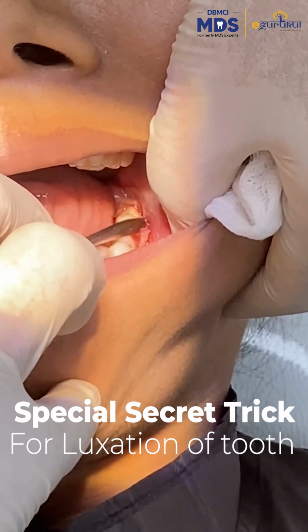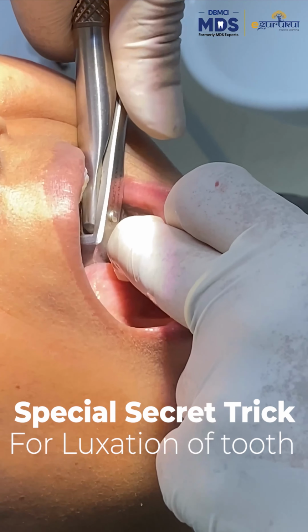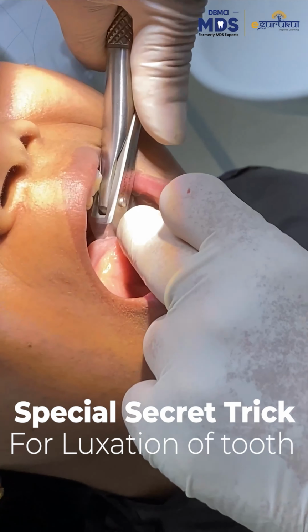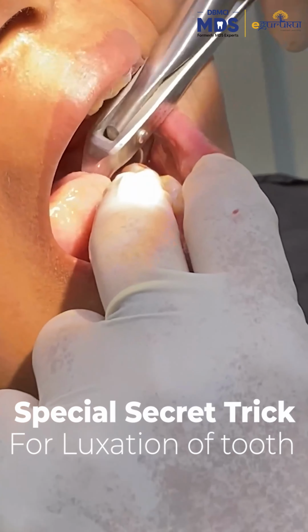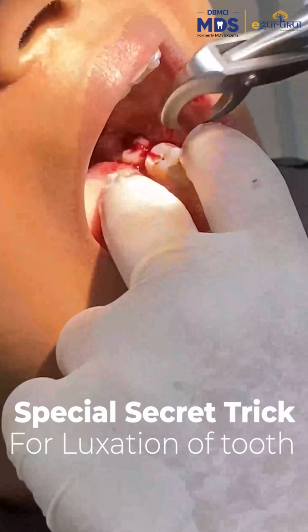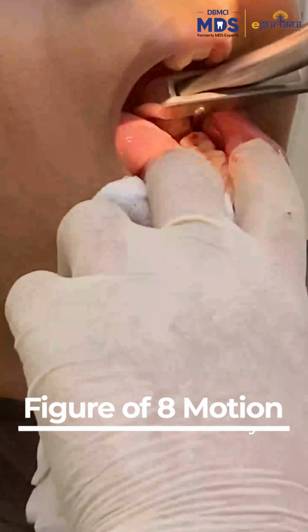I am using a cow horn forceps between my second and third molar. I am stabilizing my second molar with my finger, and between the second and third molar I am using my cow horn forceps. This will help to luxate my third molar tooth. Now this is one trick which comes only with clinical experience, using a cow horn between the second and third molar to luxate the tooth. Now simply using a lower molar forceps in a figure of 8 motion.